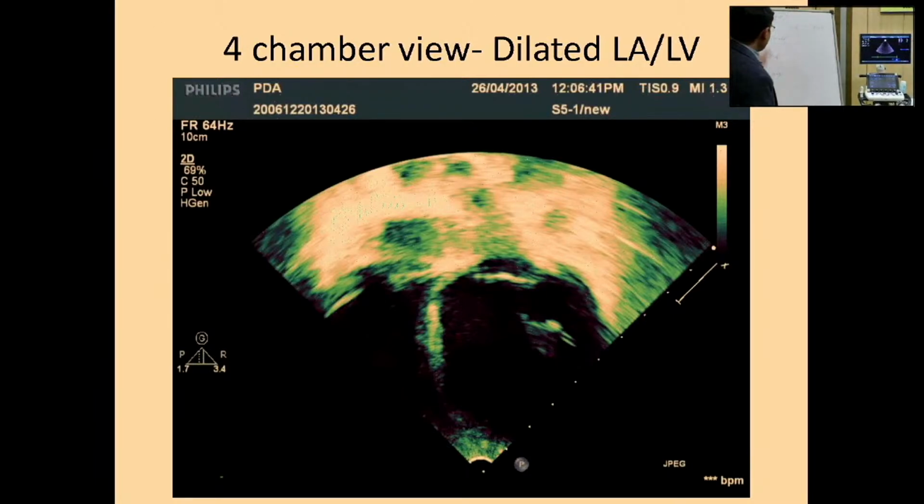How do I define a small shunt? In these two terms: cardiomegaly, PH. Cardiac enlargement and PH. Small shunt means such a small shunt, no load on the heart, nothing. Yes, this is a small shunt. So if my echo says there is no cardiomegaly, my X-ray says no cardiomegaly, there is no PH, this is a small post-tricuspid shunt. I am talking about post-tricuspid, repeatedly saying either VSD or PDA.